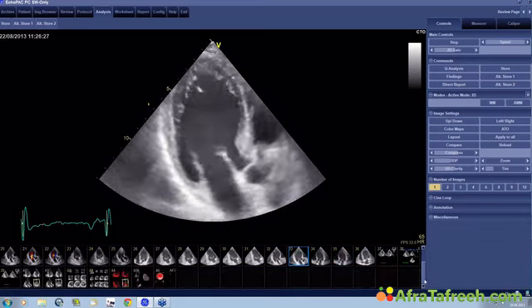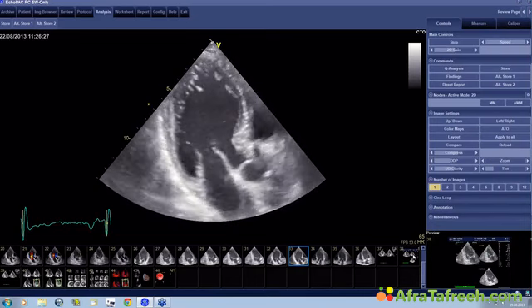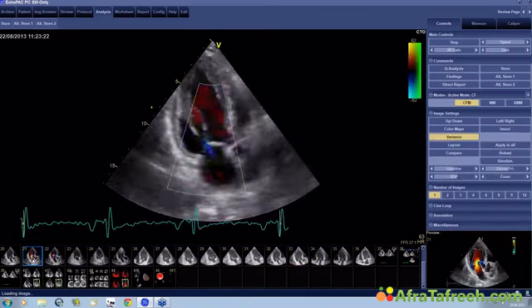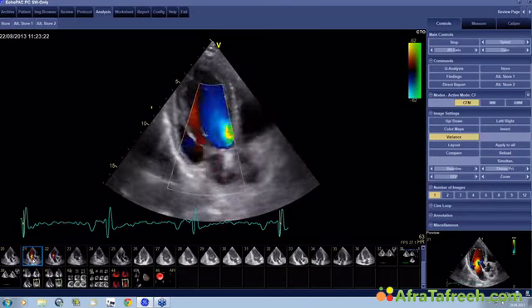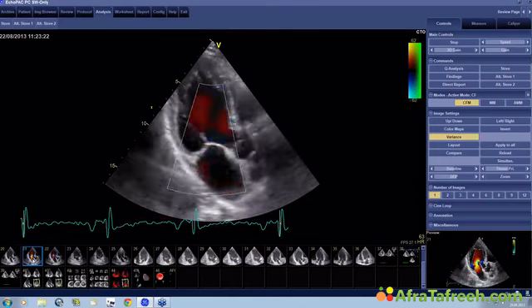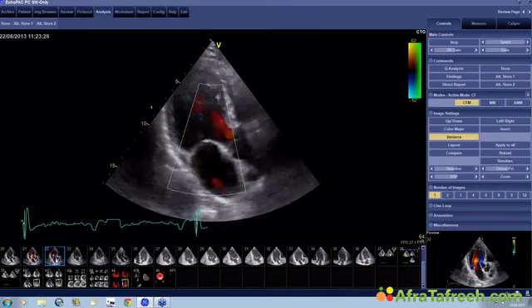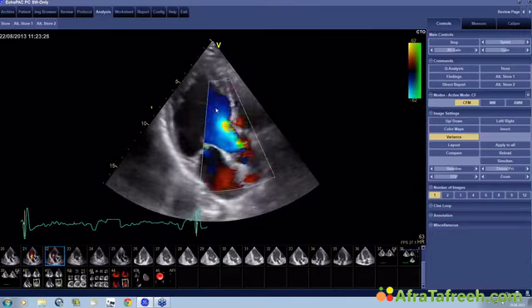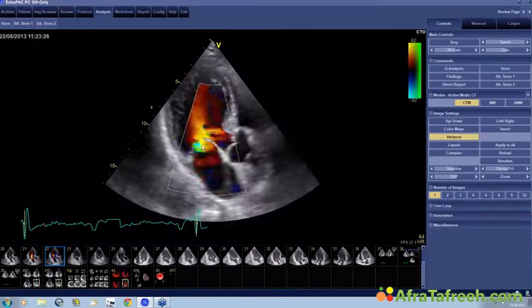Before I turn to the angiogram of this patient, just let me show you what else we do in these patients. We look at the valves. Why is this so important? Because it gives you information if we have some form of mitral regurgitation, for example, which is caused by the infarct. Remember, infarcts can cause secondary mitral regurgitation by influencing the geometry of the mitral valve. For example, in inferior infarcts, you will frequently see a so-called restricted posterior leaflet, which causes MR. This is not the case here. There's only mild MR here.